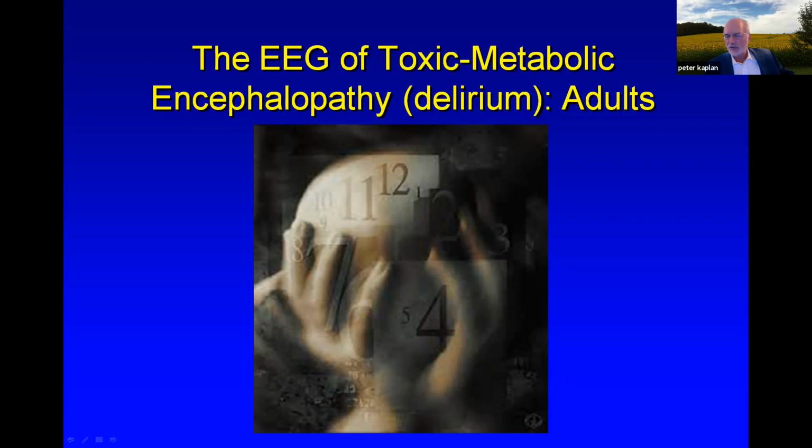This is evidenced by the fact that if you then give a sternal rub, once they've gone away, the triphasics almost immediately come back with arousal. So it's a state change that causes them to go away. It's not an anti-epileptic effect of benzodiazepines. So there doesn't seem to be much promise in trying to treat them with something that makes the waves go away, and benzos are the only thing that does that actively. It's treating the underlying cause of the triphasics, which seems to be the only thing that we could modify.